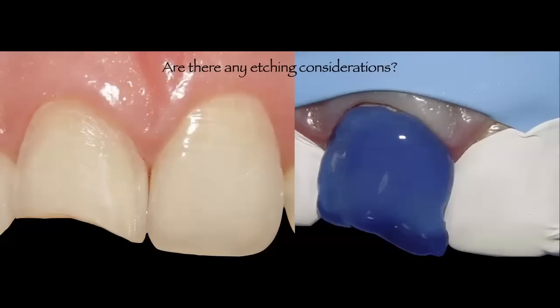Now, the other aspect is that when you are etching and you're restoring either a single tooth or multiple teeth, I would highly recommend that if you're doing it one by one, or in this particular case where I'm only restoring one central incisor, you place Teflon tape on the neighboring teeth so that you avoid etching the enamel surface on those adjacent teeth. Again, just Teflon tape, protect the teeth, and then you go about acid etching. 15 seconds for cut enamel, 30 seconds dynamic etching for uncut enamel.